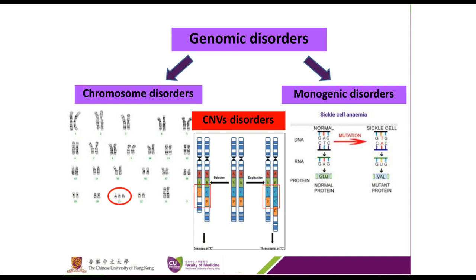Or in the old days, we know that all the Mendelian disorders are mainly because of a monogenic disorder that we can characterize by Sanger sequencing. So with that, what we now look for is a technology that can take care of both the chromosomal disorders that I show here, as well as the pathogenic copy-number variants that have been highly appreciated in the last 15 years with the discovery of new microdeletion and microduplication syndromes.